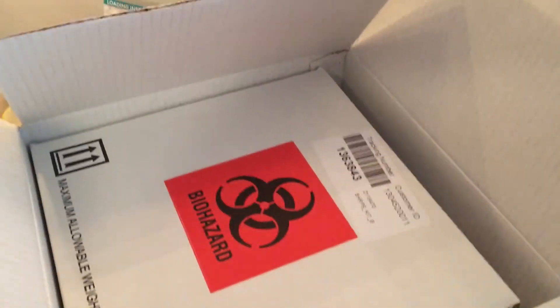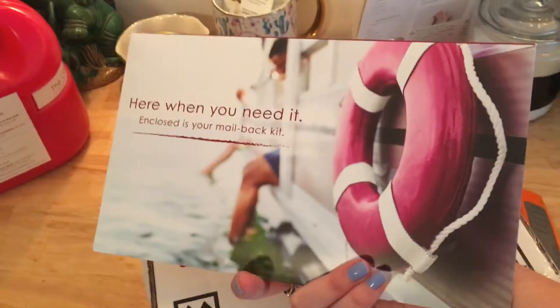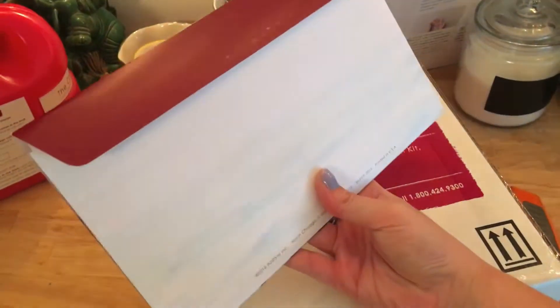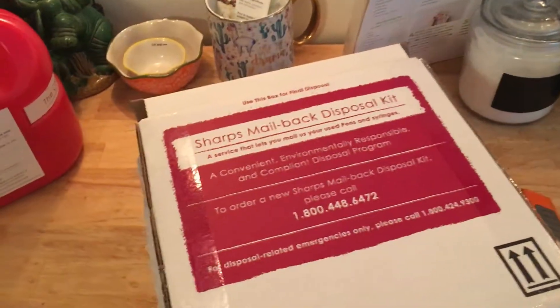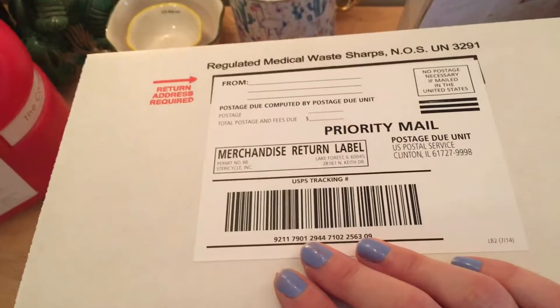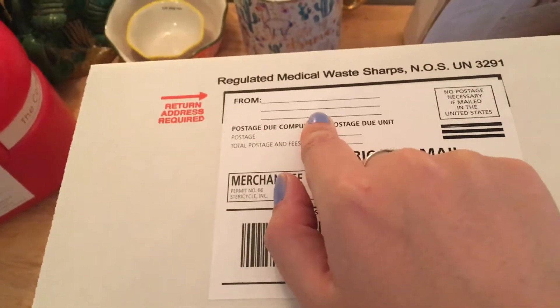This is what it comes with: a box and a pamphlet of information. This is probably really important for you if this is the first time getting this package — it's something you can keep in your files. It's just some general information the company offers. Up top, everything's pretty much ready to go — the only thing you need to provide is your own personal information.